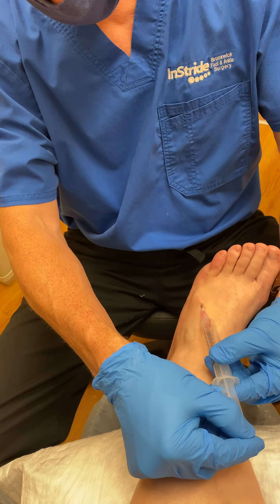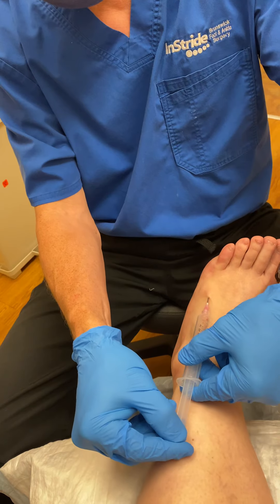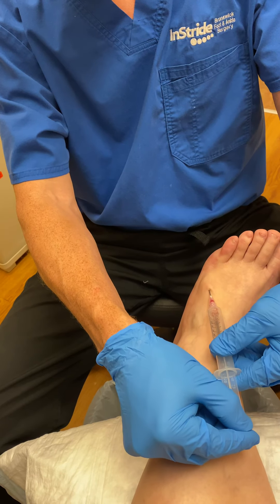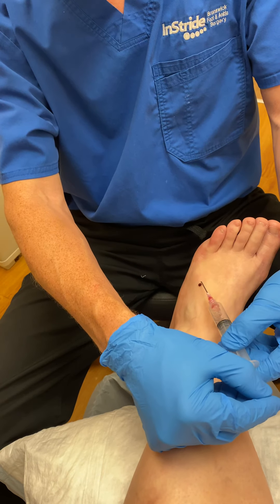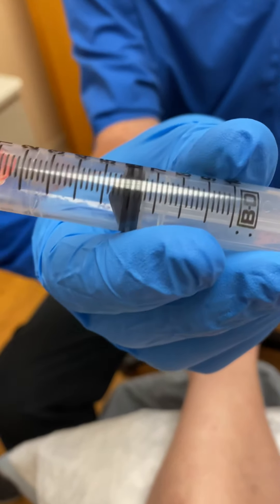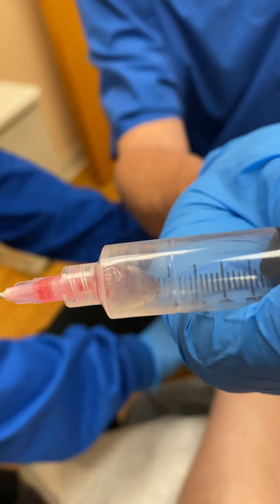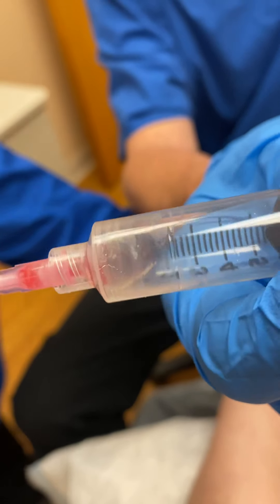We're just moving it around, puncturing through to get all aspects of it, trying to break it up. There's a little bleeding, but inside there are the contents of the ganglion — a gelatinous type of material, almost apple jelly in appearance.